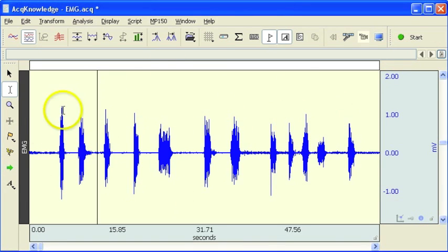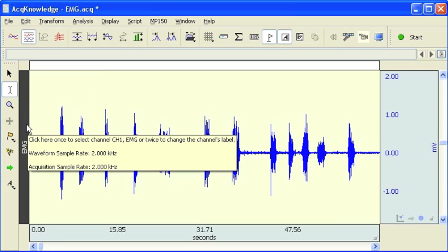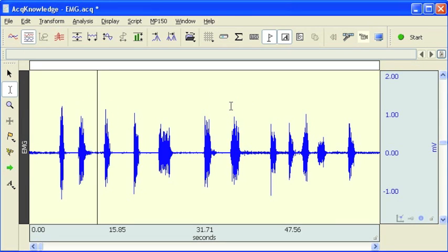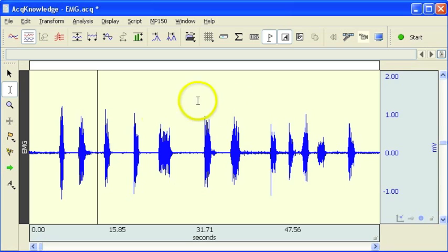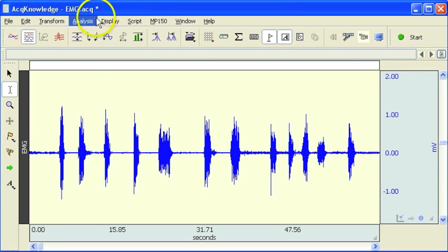I've opened up a sample waveform here. It was recorded at 2,000 samples a second. Not much data, but it's enough for this particular demonstration.